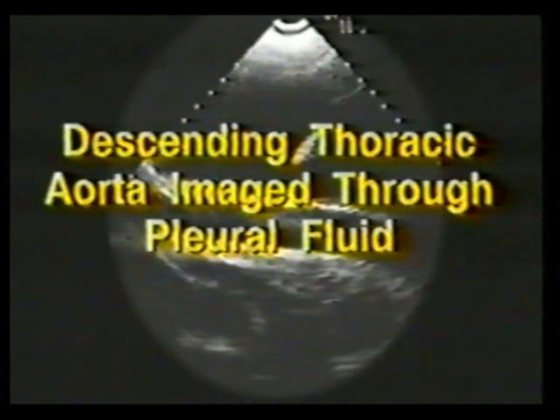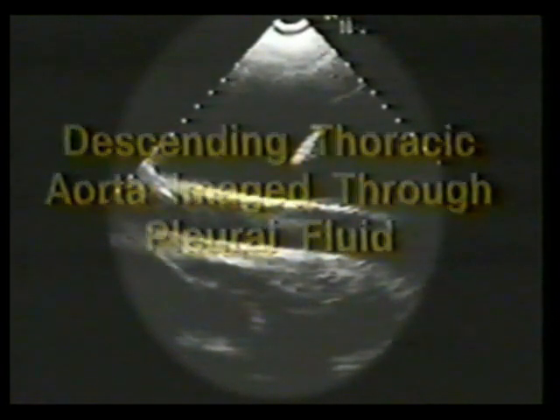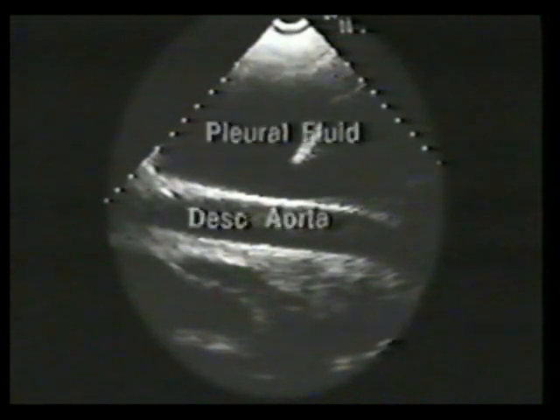Remember that patients with left pleural effusions present an additional ultrasonic window for visualization of the descending thoracic aorta. Recognizing this large left pleural effusion, we have placed the transducer near the patient's left scapula. Since the fluid is an excellent conductor of ultrasound, the descending thoracic aorta is clearly imaged. This is a fibrin clump within the pleural fluid.